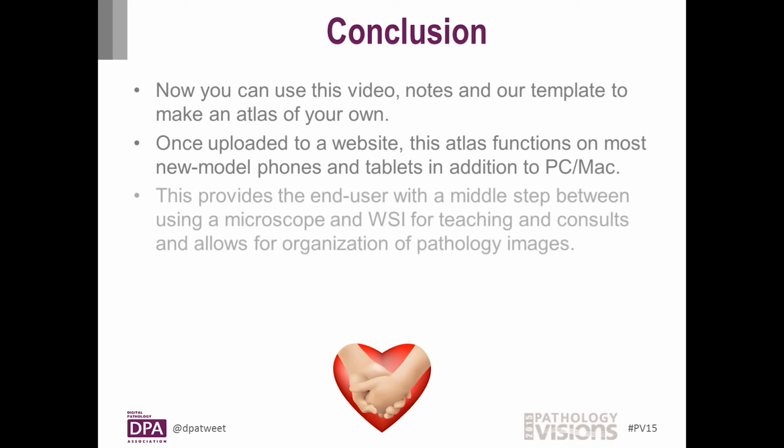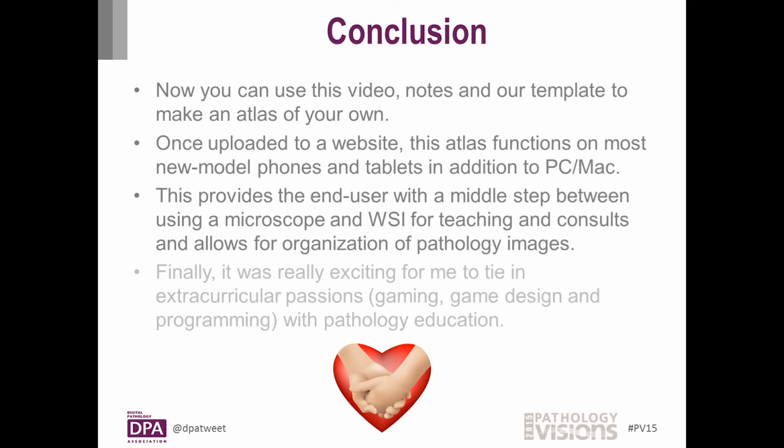This provides the end user with a middle step between using a microscope and whole slide imaging for teaching and consults. It additionally aids the organization of pathology images. Finally, it was really exciting for me to tie in my extracurricular passions with pathology education.